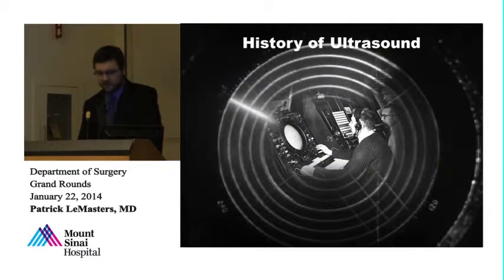So briefly, let's just go over some history. Where did ultrasound begin? Medical ultrasonography has its beginning roots with sonar developed in World War I. The first written reports of ultrasound describing abdominal disease were described in 1958, and shortly thereafter it was taken up by cardiology, radiology, and obstetrics in the following decades. The use of bedside ultrasound really wasn't used until the mid-1990s, when ultrasound became more compact and more affordable.